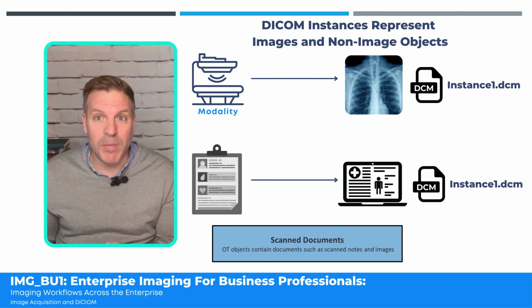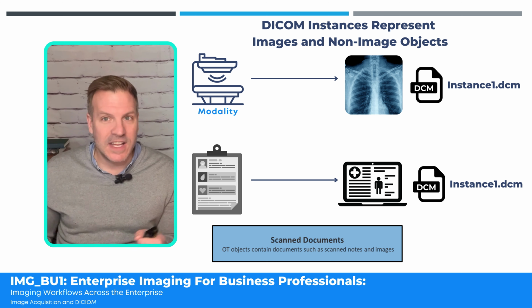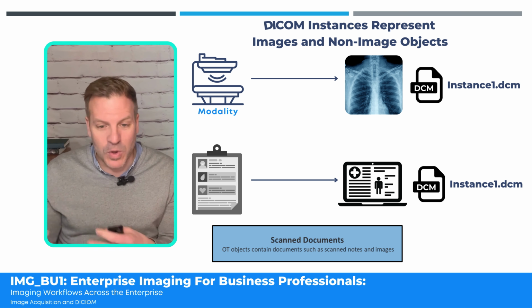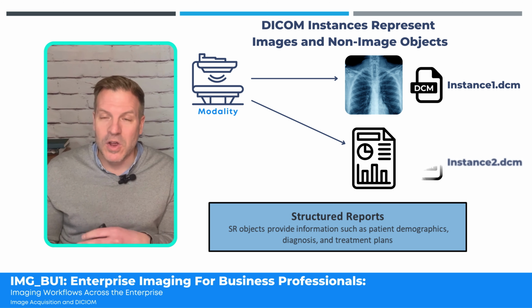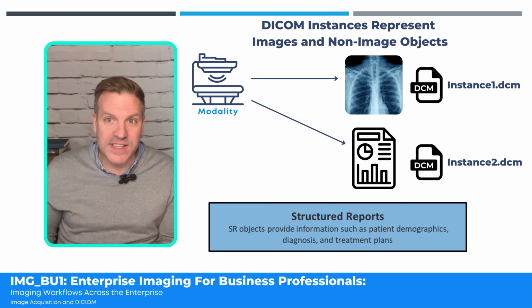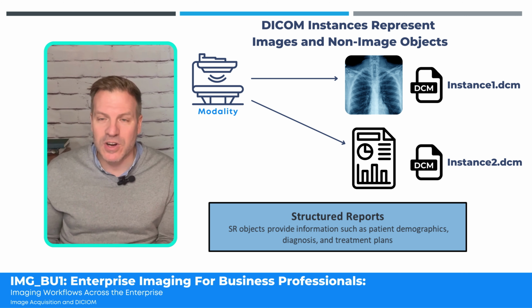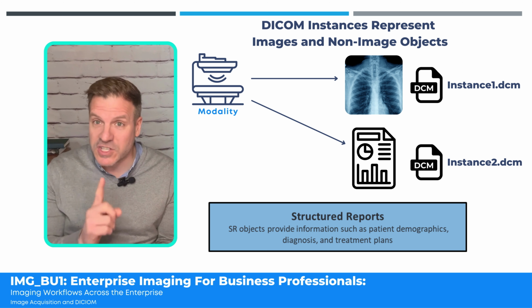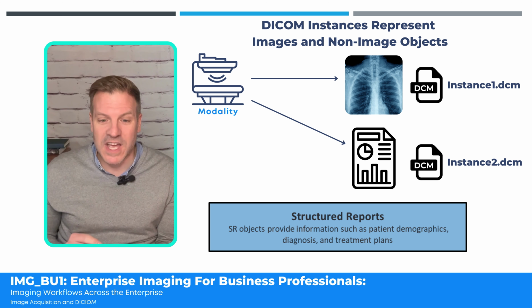It's not really part of the imaging set. It's not a diagnostic image, but it's a scanned representation. And you would also have an opportunity where if we're looking at modalities that have ionizing radiation, we may want to capture the dose that's coming out of that. We're going to touch on that a little bit more in another section.